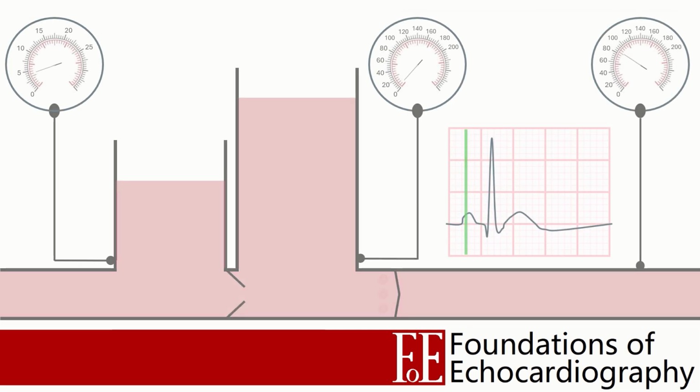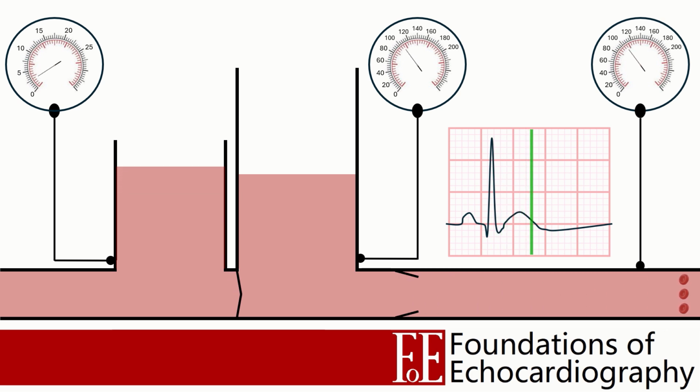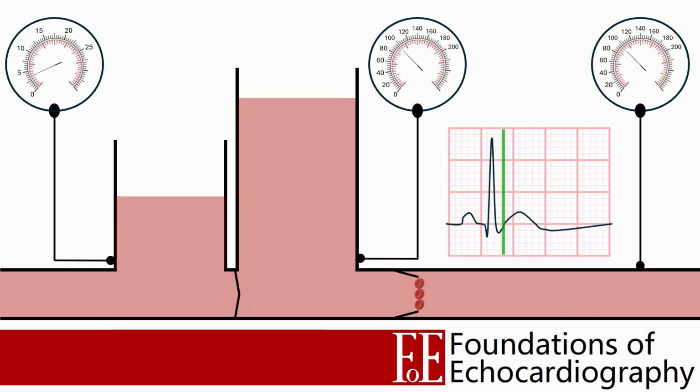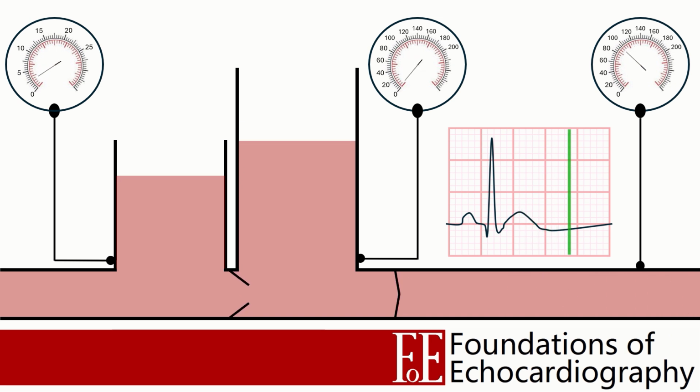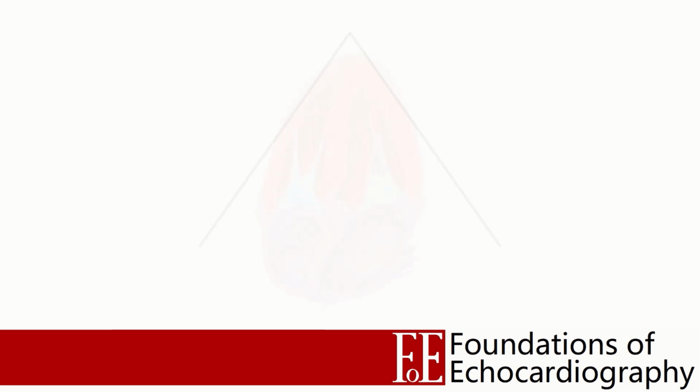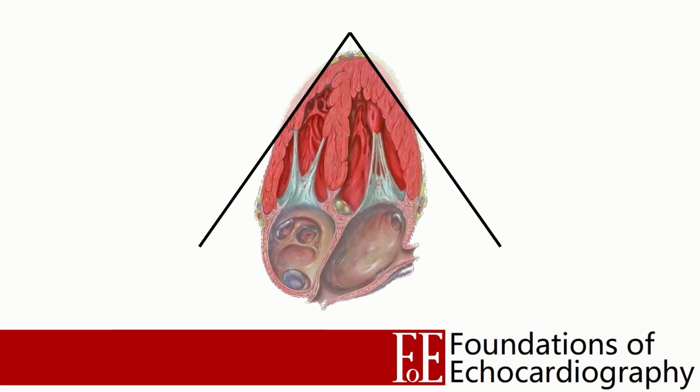Now that we've estimated the outflow tract area, we can imagine a two-dimensional disc of red blood cells sitting at the exit of the left ventricle, waiting to be ejected into the aorta. We can then use pulsed wave Doppler to estimate the stroke distance, how far the disc moves during systole. We typically make this measurement from the apical 5-chamber view, although the apical 3-chamber view can sometimes provide better alignment.